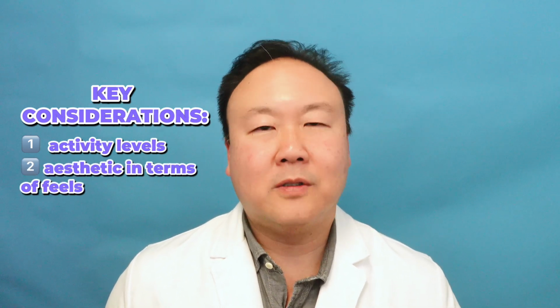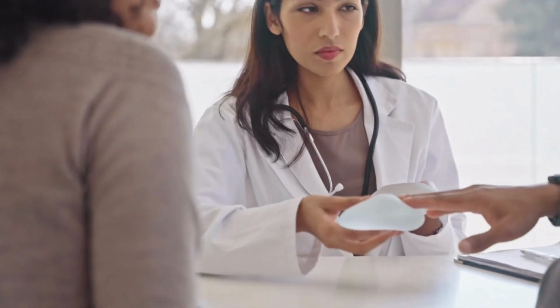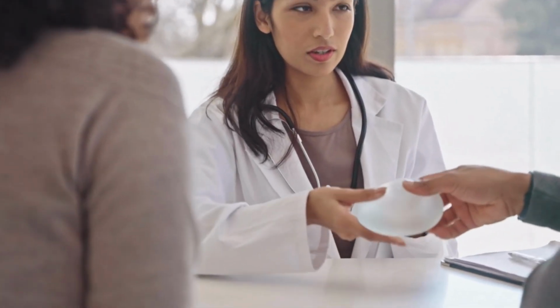Also, we do think that constant pressure of your pectoralis activating and generating a lot of force, if the implant's underneath the pectoralis, then it just squeezes the implant, and that's not really great for long-term implant longevity or how long it lasts. Another important consideration is aesthetics in terms of feel. So specifically, this may sound strange, but the more padding you have over your breast implant, the more natural it feels and the more natural it looks.